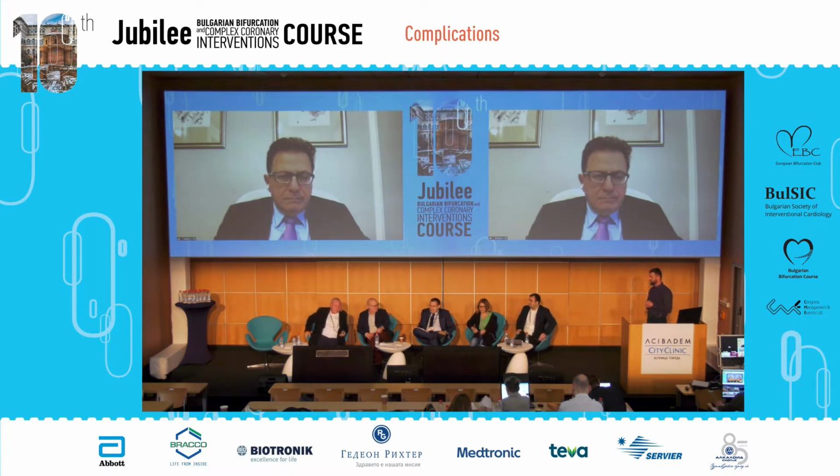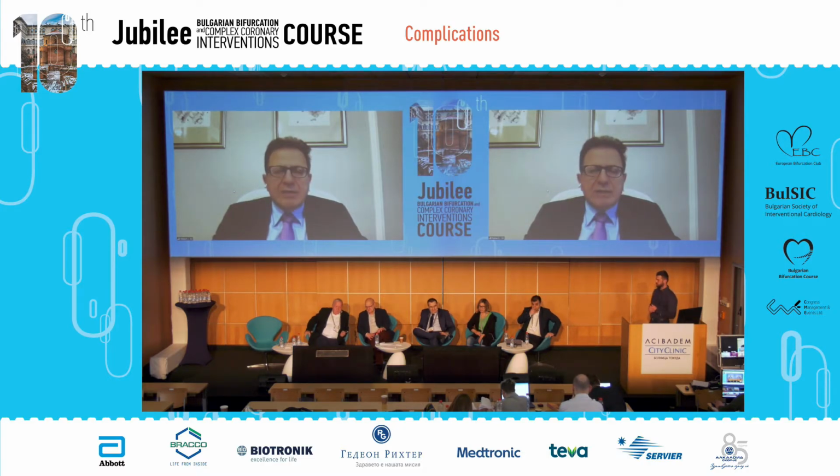So the discussion is open. So I have only one comment. This is an old-fashioned crush technique used in this complex case. And I wonder whether it was safe for such, let's say, long stenting distances to use this approach. I am afraid of the outcome of the patient.